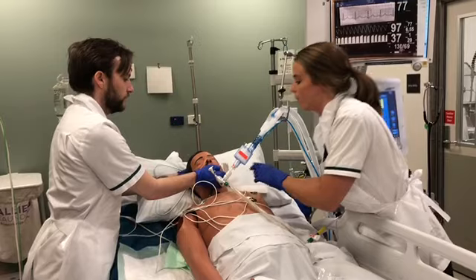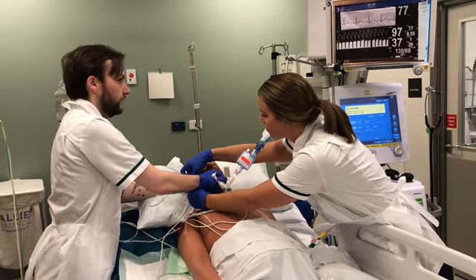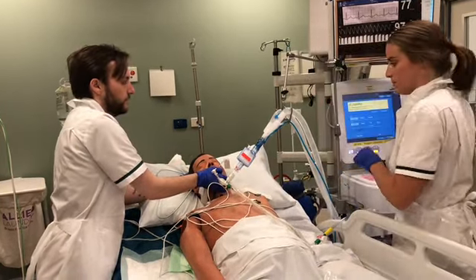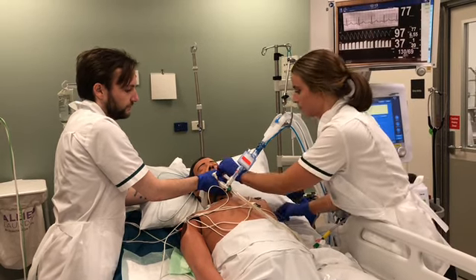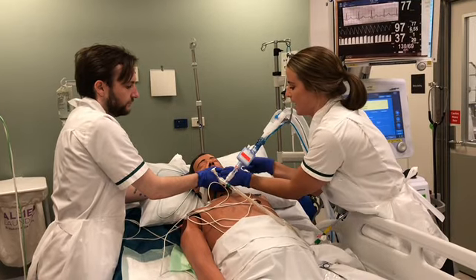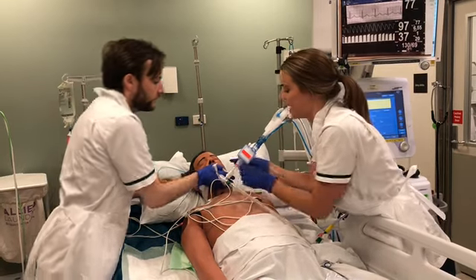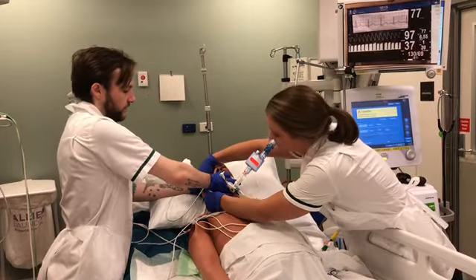Popping a bit of lip balm on the corners of the mouth. Trimming that tape down. Checking those are nice and secure, one finger under each side. And remaining 20 centimetres at our teeth.